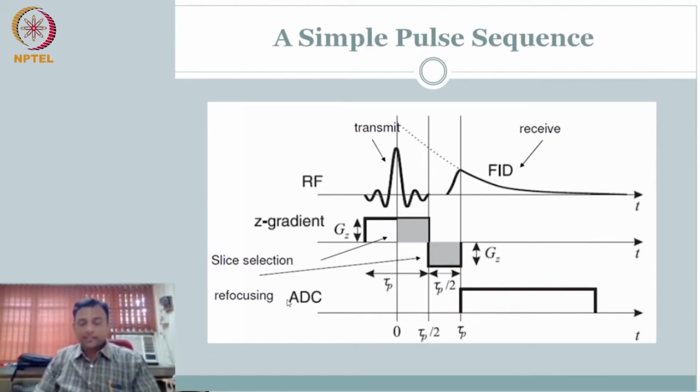Welcome back to yet another session. Here we want to proceed further. Last class, where we stopped was with regards to slice selection. So now that we have selected a slice, this is the sequence diagram that we represent, right?